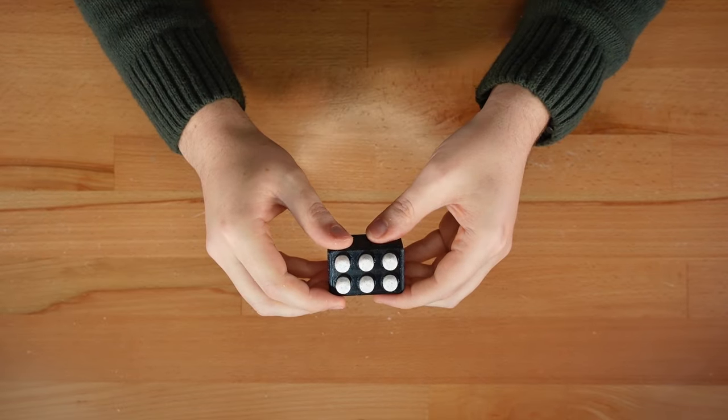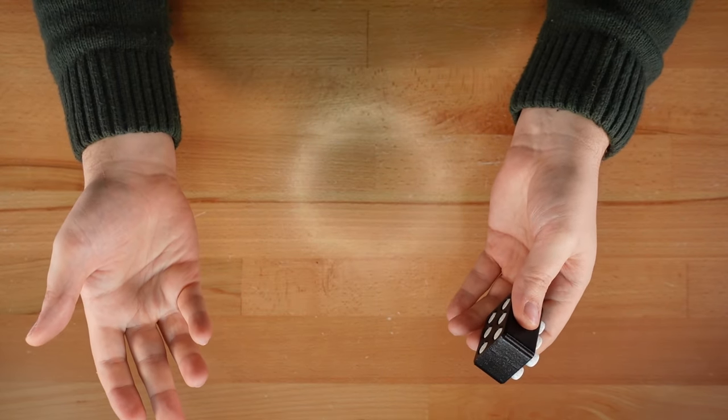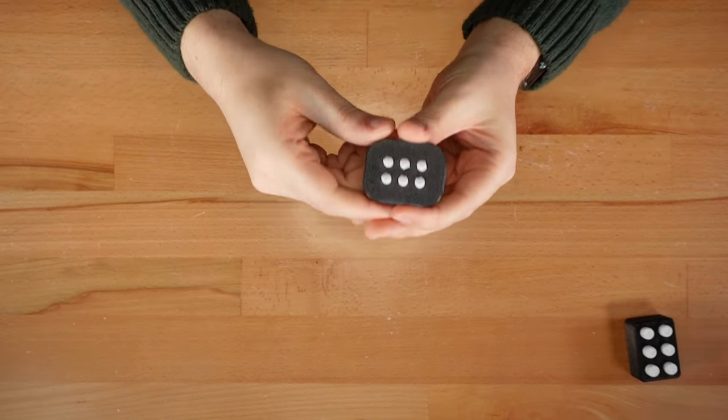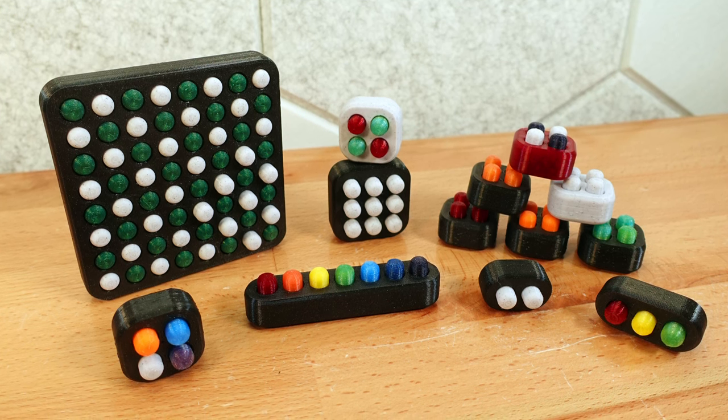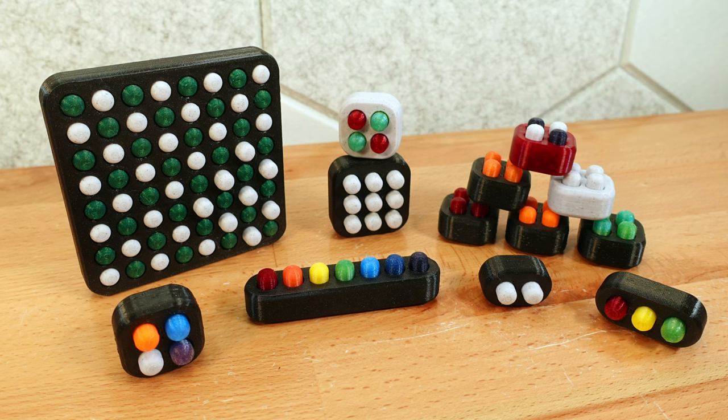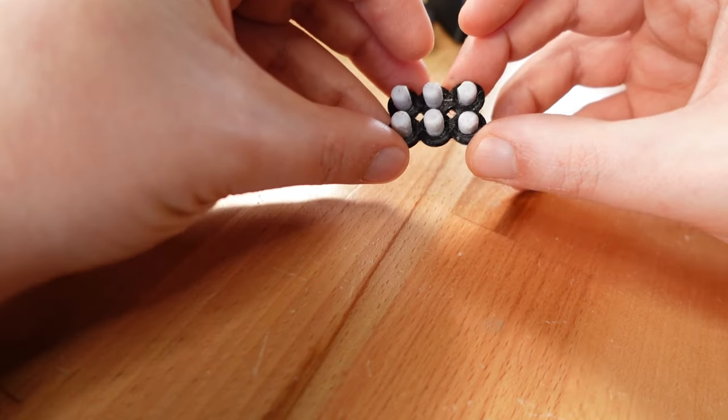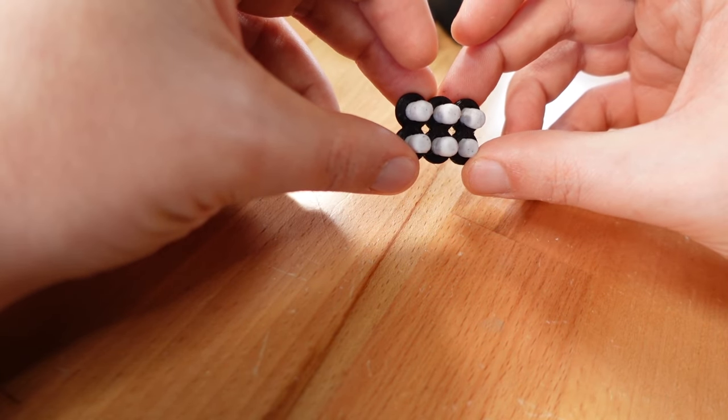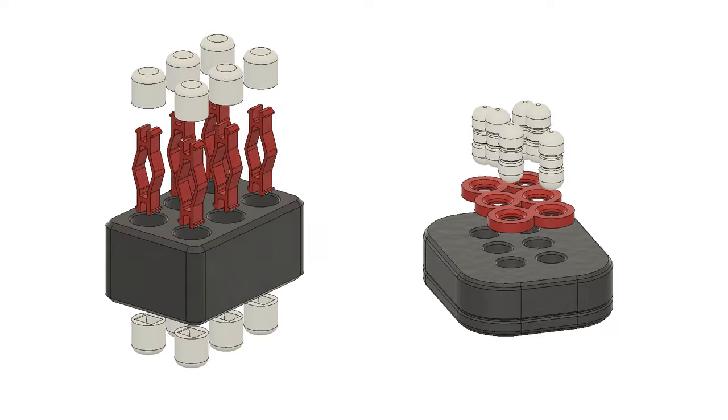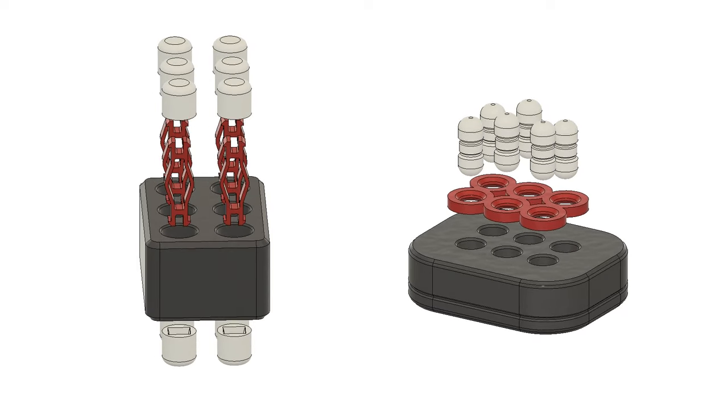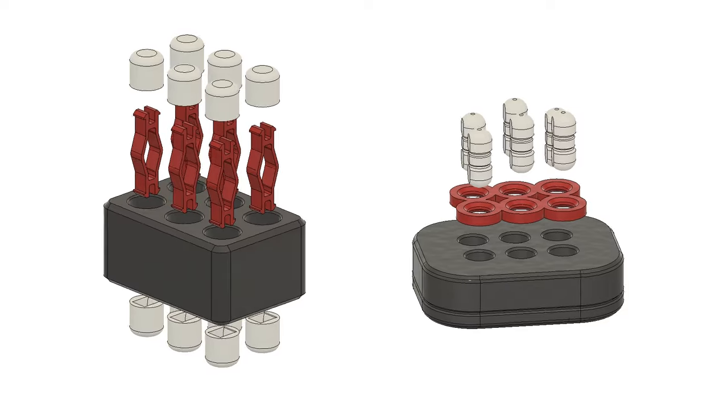So with those challenges in mind, let's make something better. This is the new 3D printed braille cell. The design is inspired by my recent pop fidgets. Instead of 6 individual springs, it uses a single TPU gasket, which flexes to allow the buttons to pop back and forth. This also reduces the number of parts from 19 down to 8.